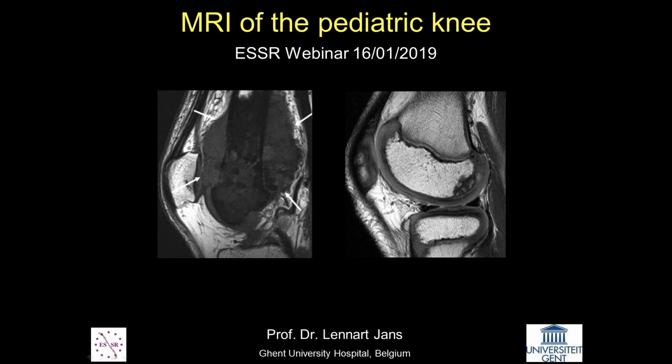So, good evening, everybody. Thank you very, very much for being here still at this time of the day. So, I will be discussing MRI of the pediatric knee with you.